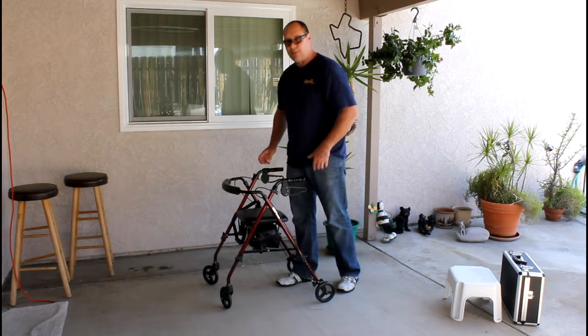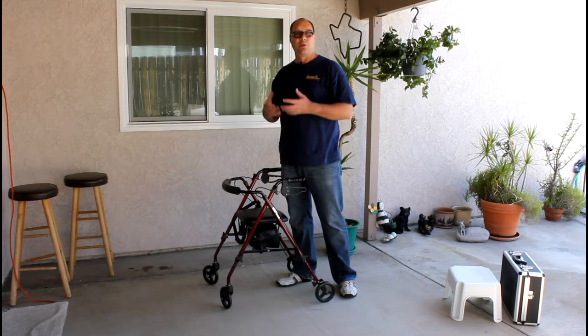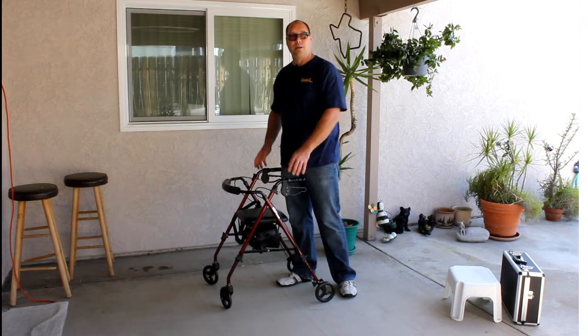Now, everybody using a walker has probably developed a bad habit of using it, so we're going to get into how to actually use the walker the proper way later. But let's get into the maintenance part.